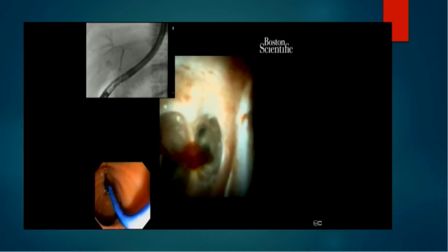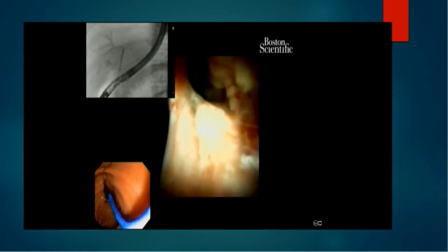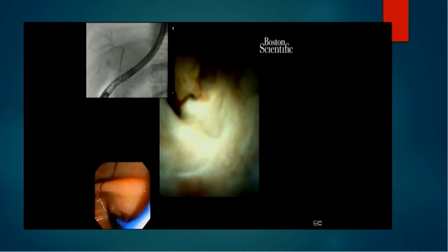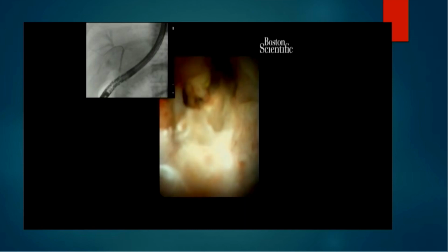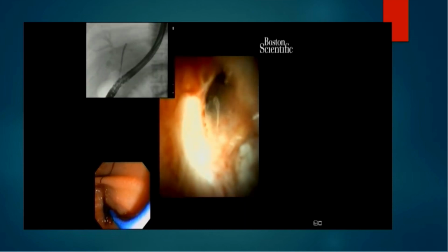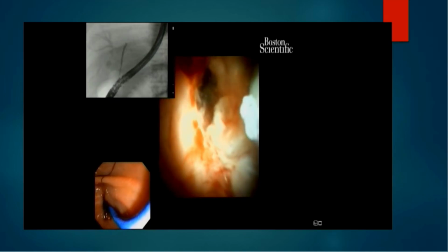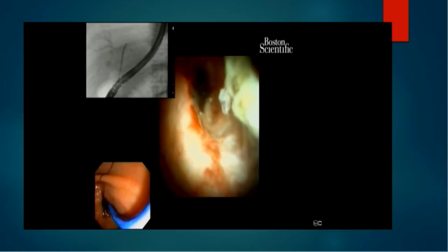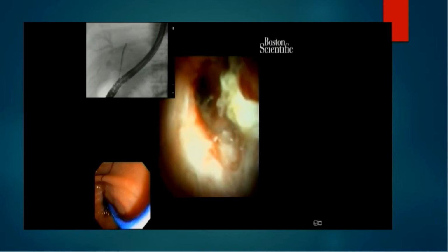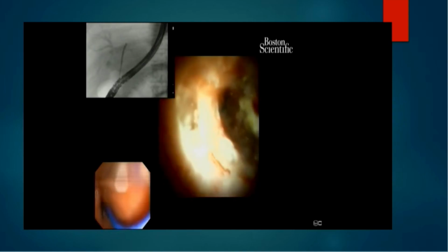because this is the hilum here, and on the left side you have these tumor changes. So I think it's very obvious from this video that you can appreciate the tissue where you need to biopsy, but you can also very, very distinctly delineate the extension of the tumor, which is extremely helpful for the surgeons planning resective surgery.